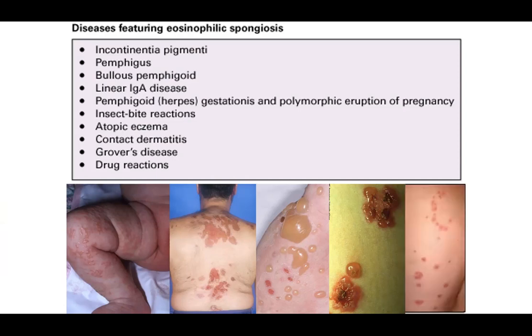Of course, you can have other reactions on the body, including insect bite reactions. You can see here, this looks like the insect's been traveling around for breakfast, lunch, dinner, fourth meal, early breakfast again, early brunch. So I would suspect some type of insect bite reaction here. But it's linear too, so you could think about contact dermatitis in your differential as well.